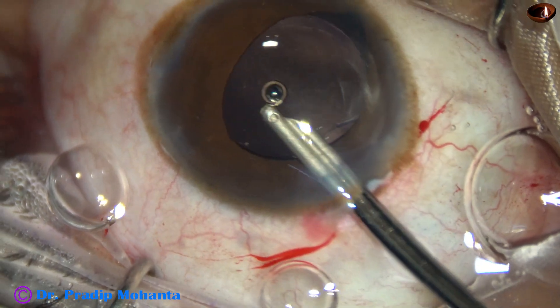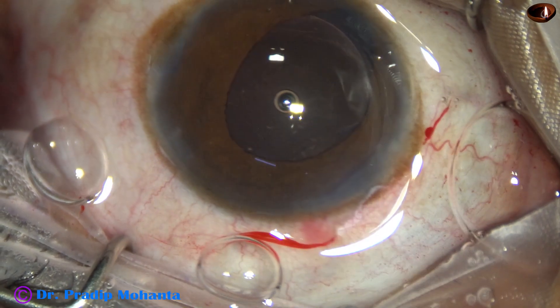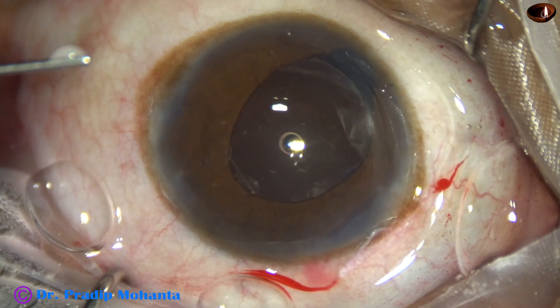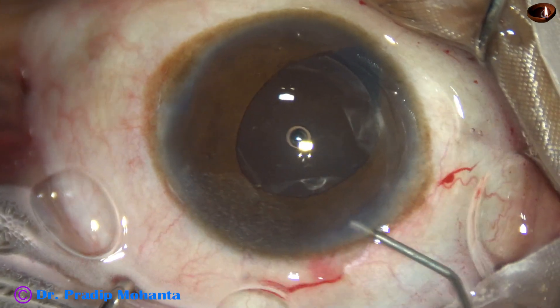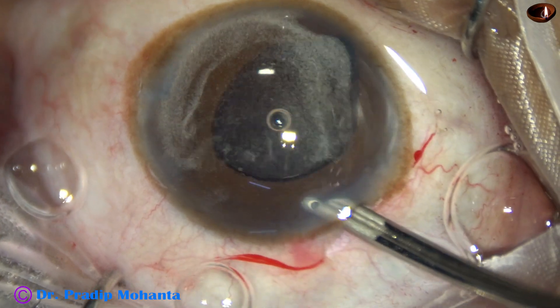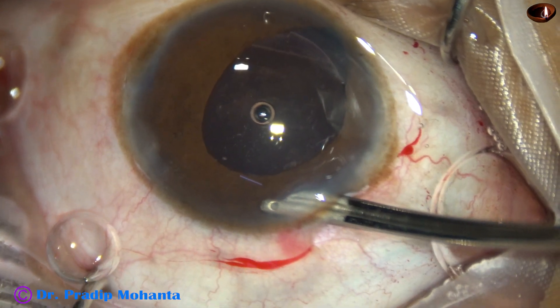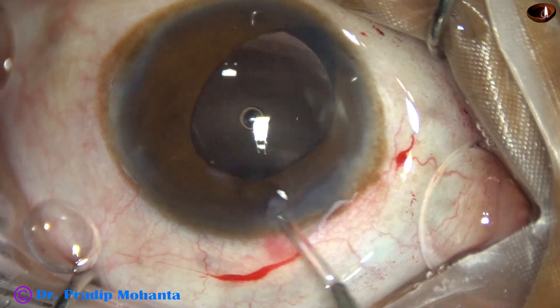Irrigation and aspiration goes together for some time. Now is the time to check whether any vitreous strand is present anywhere. Here goes the triamcinolone acetonide, and I use the Simcoe to clean it out. There is no vitreous strand — it is confirmed, there are no vitreous strands in the anterior chamber.